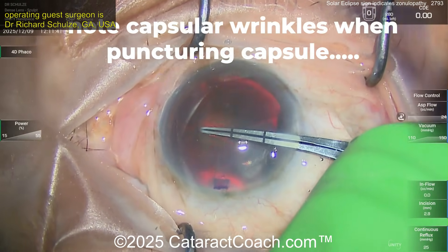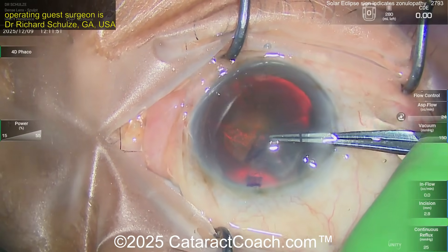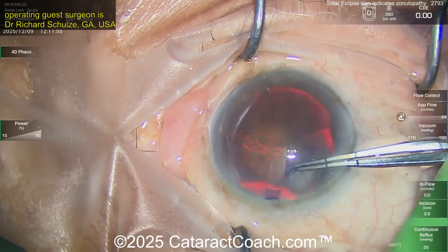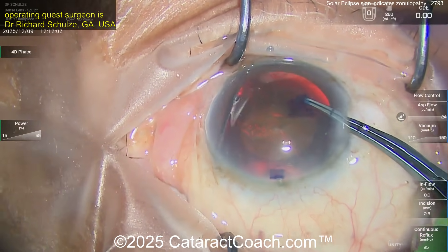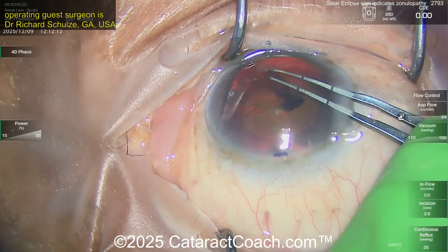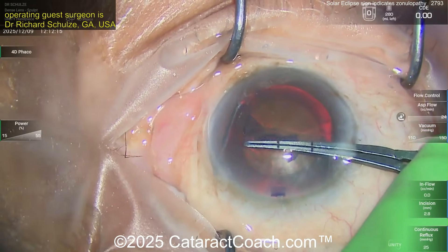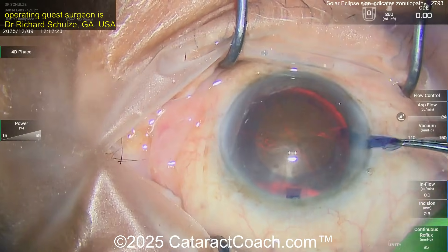Look at the wrinkling there — that wrinkling indicates zonular weakness. So maybe this wasn't a traumatic cataract; maybe this is global zonulopathy. Despite having that wrinkling, you're still able to complete the rhexis. The question is: it's more challenging whether you have global zonulopathy or focal traumatic zonulopathy, because you may take a slightly different approach in each case. There's a beautiful-looking rhexis there — five millimeters, right on target.